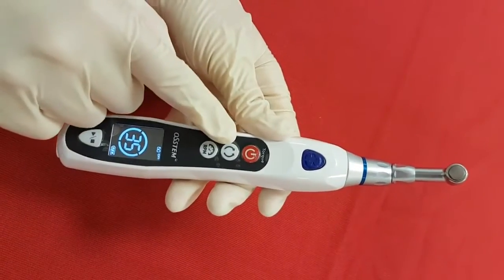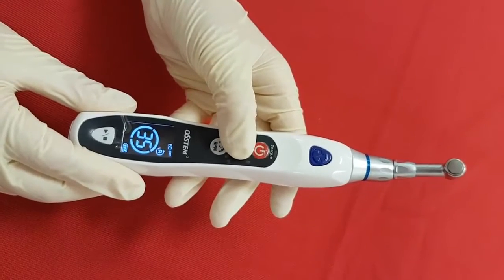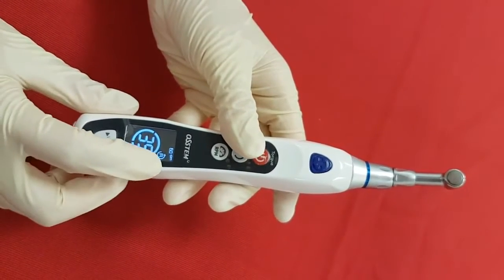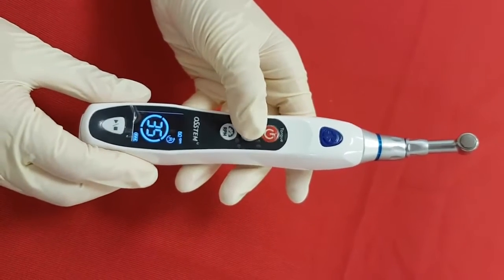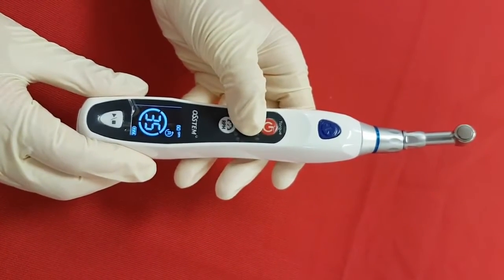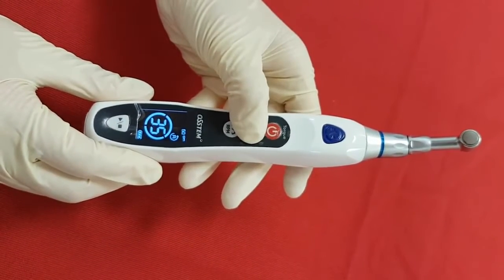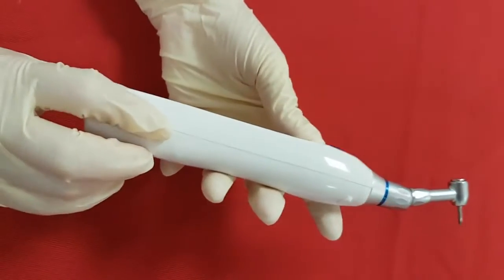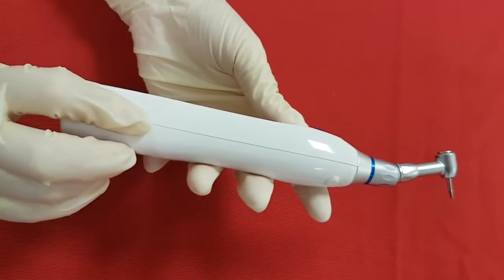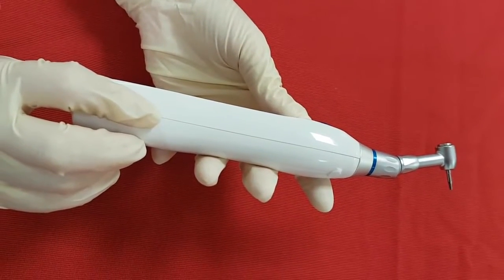Now, the direction button. This is set to clockwise and you can change it to counterclockwise with this button — the reverse mark will appear on the LCD. We are going back to clockwise for the demonstration. This button also has another function: auto calibration. Calibration is performed when this button is pressed for longer than 2 seconds, and it will be completed in 3 seconds.